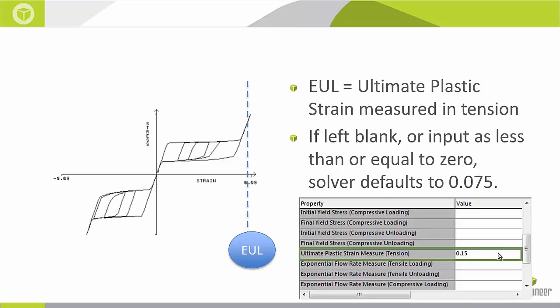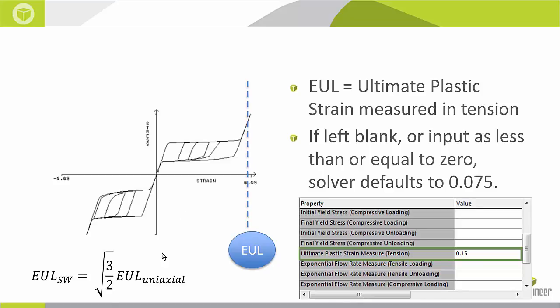If I leave this value blank which I can, the solver is going to default to the value 0.075. Now this value is multi-axial so it's the ultimate plastic strain in all different axes. However when I'm creating this stress strain curve I'm very likely running a lab test using a uniaxial tension test. So I'm going to be getting ultimate plastic strain in a uniaxial direction. I need to convert that into a multi-axial value. SOLIDWORKS recommends you just multiply that uniaxial value by the square root of 3 halves and just type in this number into your material model in SOLIDWORKS.